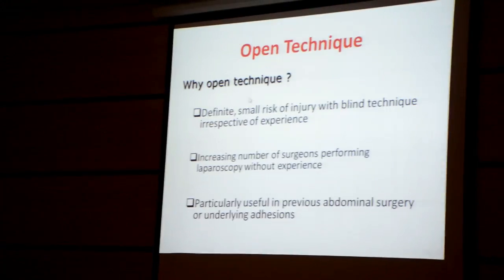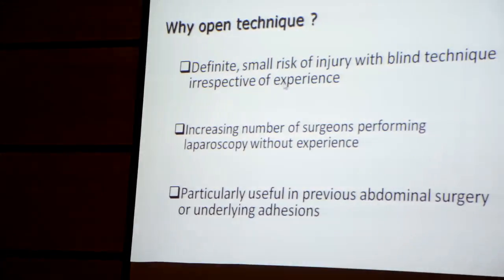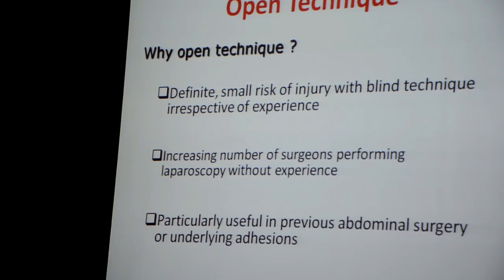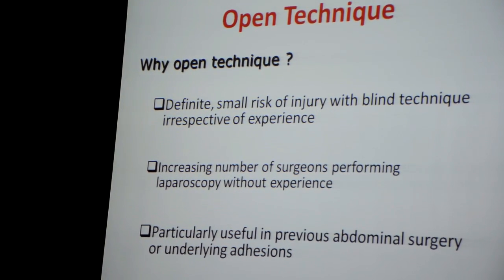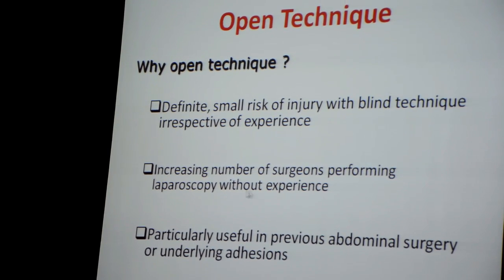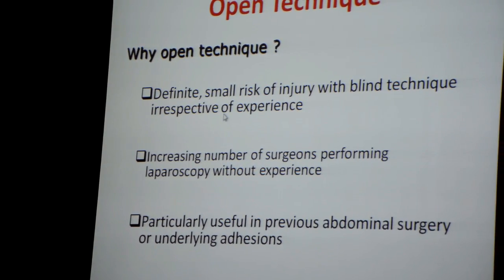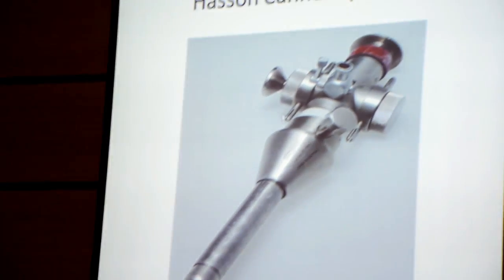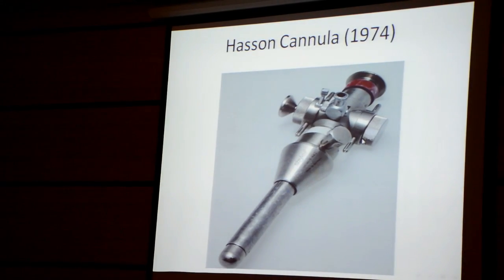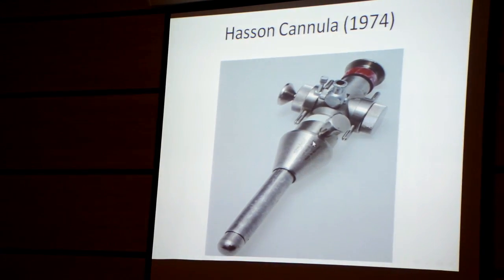Why the open technique? As you know, there is a small risk of injury with the blind technique, irrespective of experience. It doesn't matter how much experience you have; it's very important to be careful at all times. It is increasingly important with more surgeons performing laparoscopy without experience, and particularly useful in previous abdominal surgery or underlying adhesions. And as you know, the Hasson cannula or Hasson port is the easiest and safest port that can be used, which is a type of open technique.